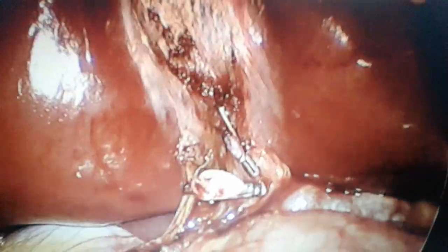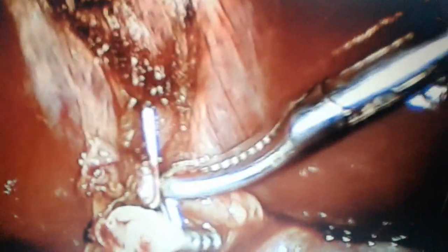So take home message: any freely falling body or any foreign body that is lying and not required inside the peritoneal cavity during the procedure should be taken out. Now see, this is the clipped cystic artery, this is the clipped cystic duct, this is the duodenum, the gallbladder fossa very nicely dissected till now, and we are just holding the cut end of the gallbladder with an instrument.